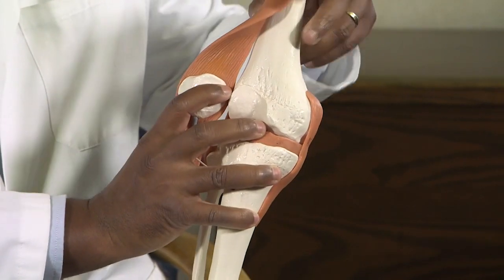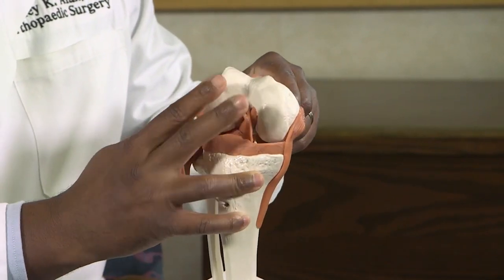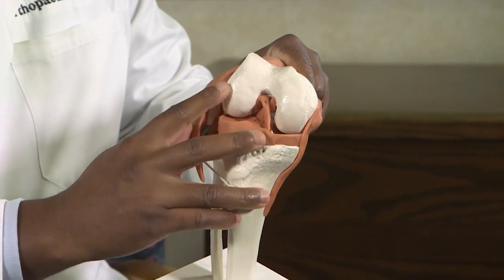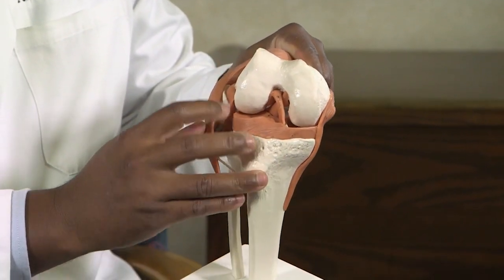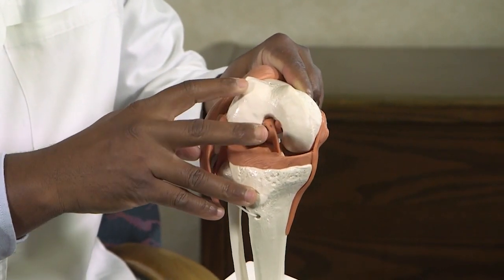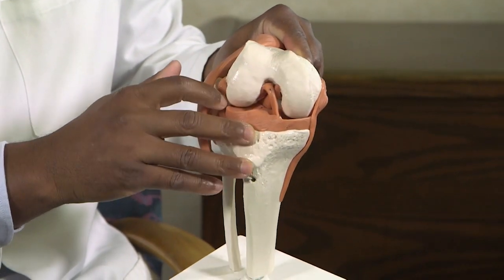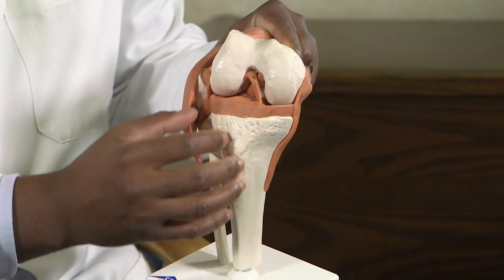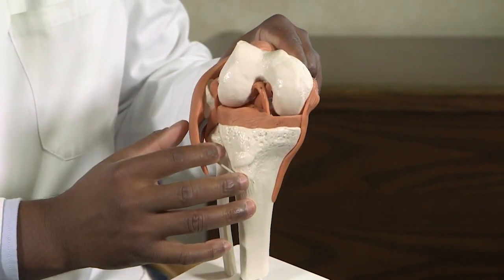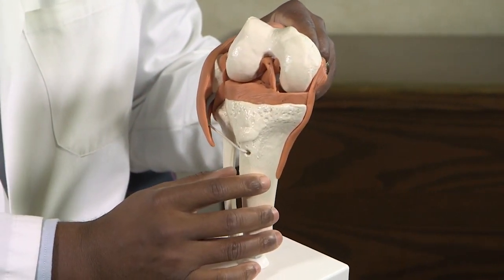Following that, we will flex the knee up and prepare the end of the femur to accept a femoral component. This involves making several cuts: one at the end of the bone, one on the top of the bone, one on the bottom of the bone, and two angled cuts in the middle of the bone, so that the implant, which is fashioned in the same manner as the cuts, can be placed on the end of the bone and secured with bone cement.